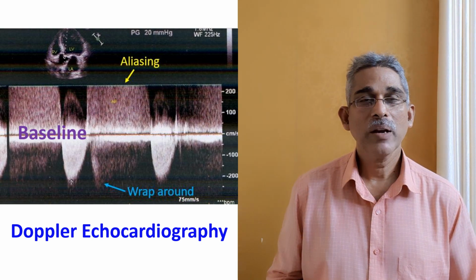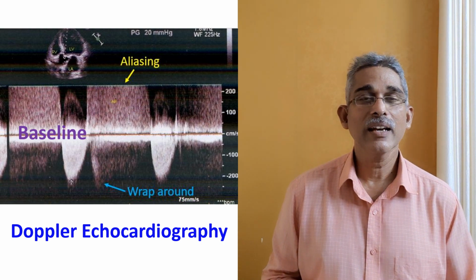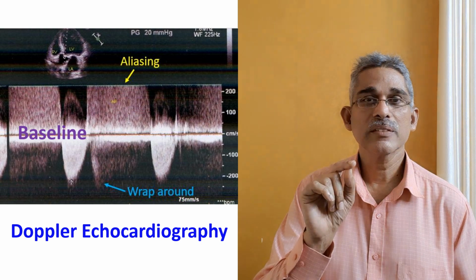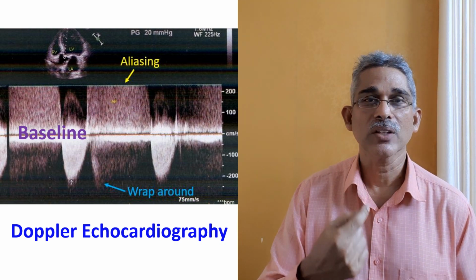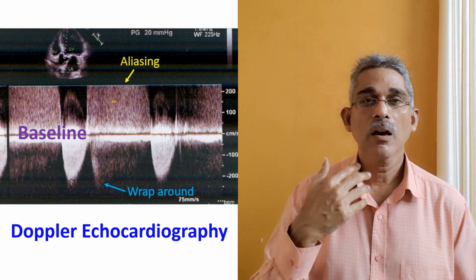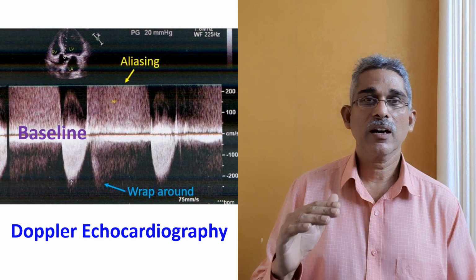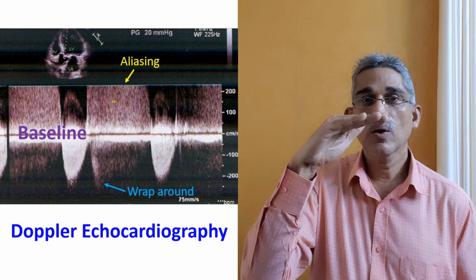And when the Doppler shift or change in frequency can be detected, you can find out the velocity of the train. Similarly, the ultrasound beam is focused on the red blood cells in the heart and the blood vessels, so that when the reflected signals are received, you see the change in frequency. Suppose you are sending out 2 megahertz and there is a slight change in the received frequency, whether it is increasing or decreasing, you know whether the blood cells are moving towards the transducer or away from the transducer.